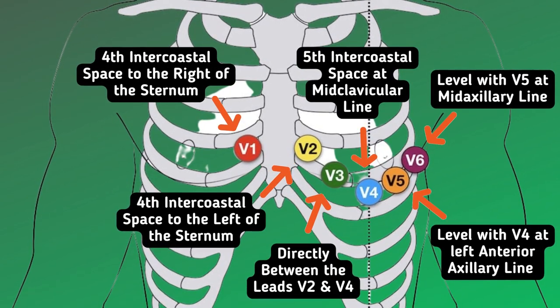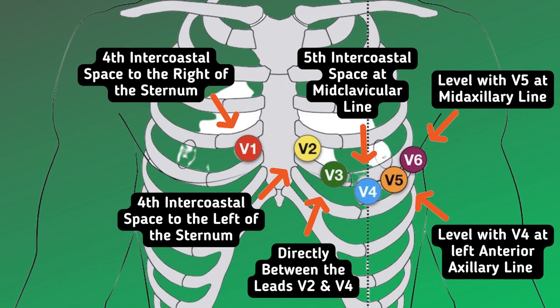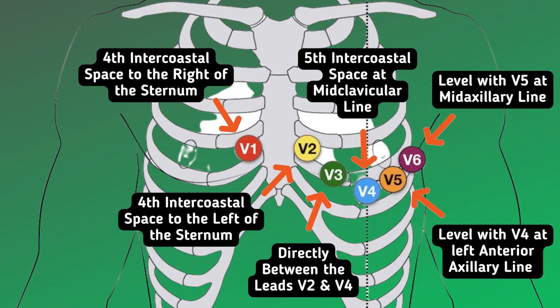V2 is the 4th intercostal space to the left of the sternum. V3 is directly between leads V2 and V4. V4 is the 5th intercostal space at the midclavicular line. V5 is level with V4 at the left anterior axillary line. V6 is level with V5 at the mid axillary line.